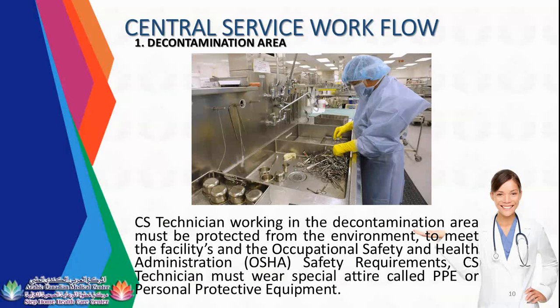So in this area, in the decontamination area, you need to have full PPE gear. PPE is your personal protective equipment, your protection against any harmful substance, because you are using chemicals, and to protect yourself from pathogens or any infectious organism.